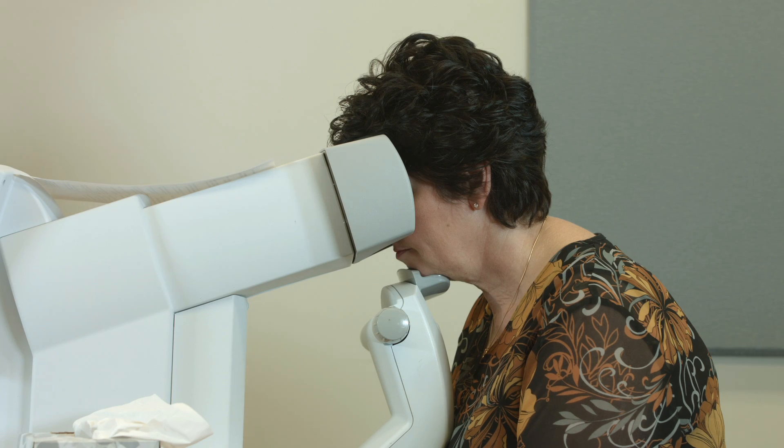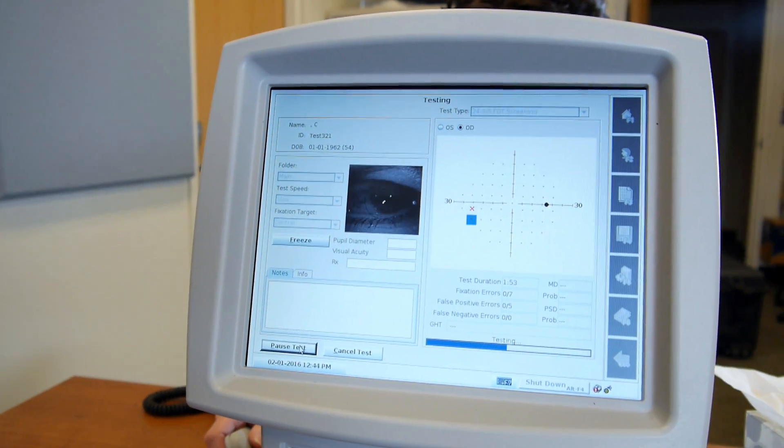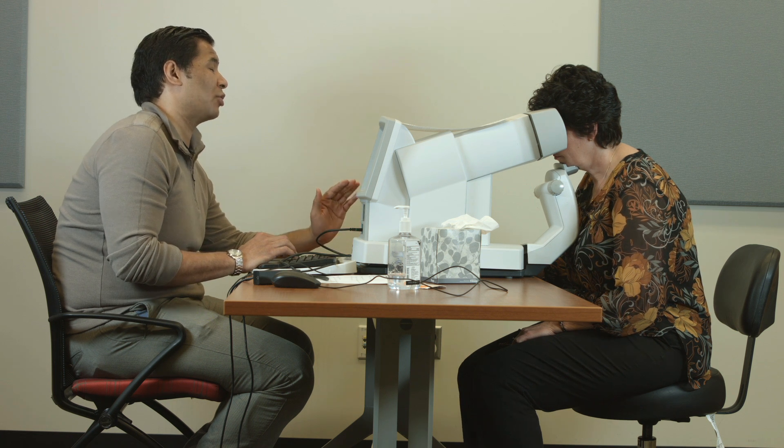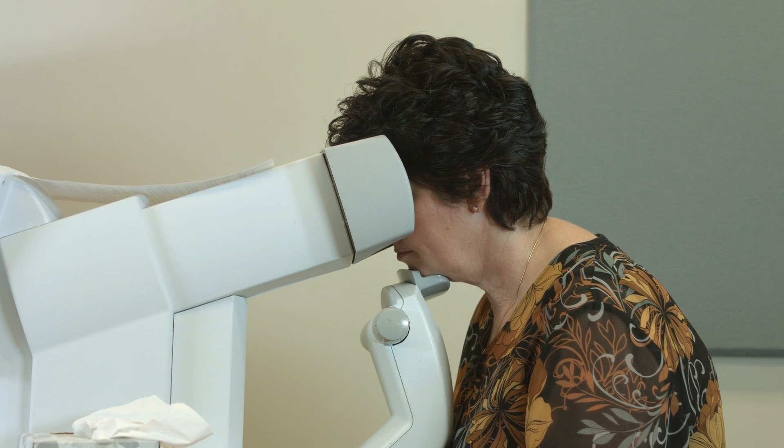Issue 4: Patient has difficulty focusing. Pause the test and review the instructions. Ask the patient to focus on the black dot in the center and click when the shimmering pattern appears.